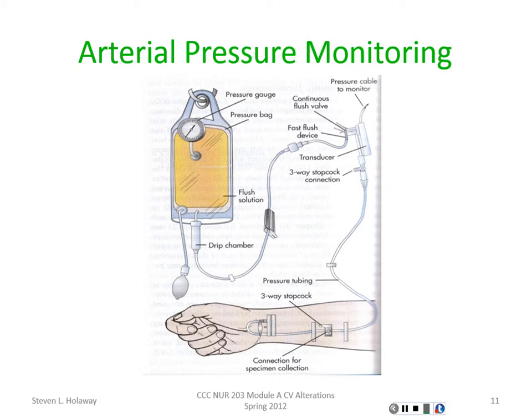And one of the things you want to make sure you do as you're setting up this set is you want to get all of the air out of that bag. The video that I have loaded for you shows a gentleman actually setting up one of these sets, and he talks about getting the air out of the set. I think he does a very good job at setting up one of these. There's a drip chamber, and different facilities want different things.